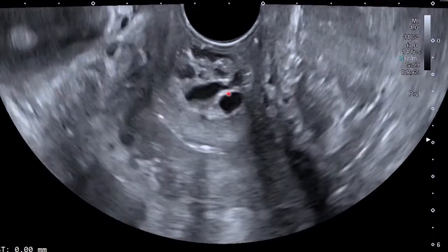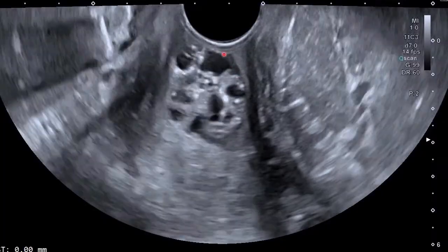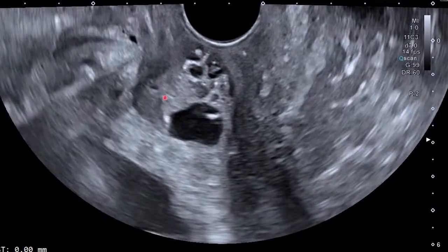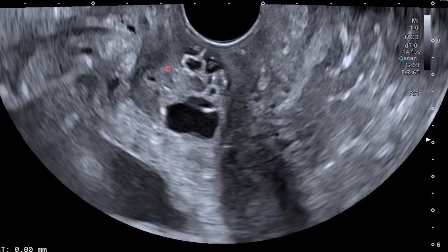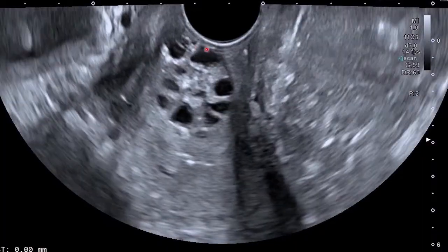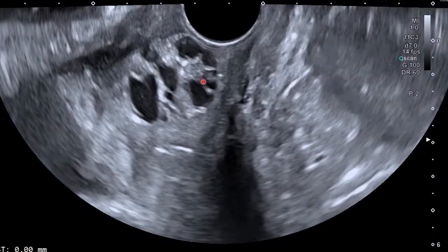The doctor sent the patient back. So now we are seeing this one. You see, it's more here. So what's your take? Help me, guys. I am also stuck.